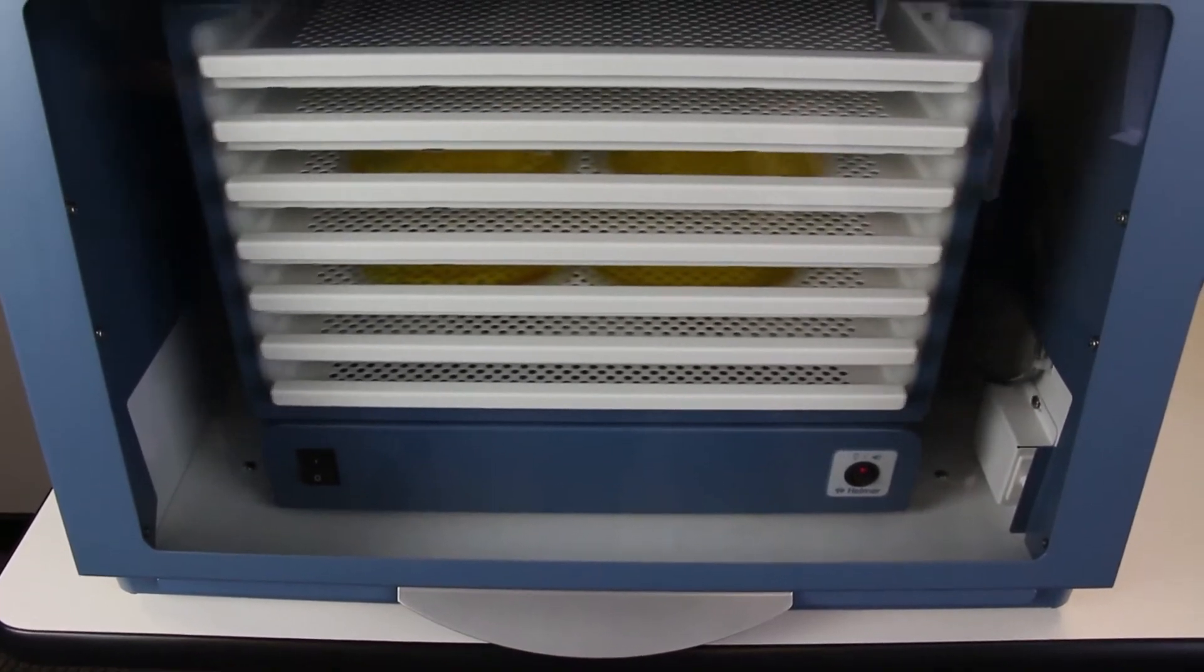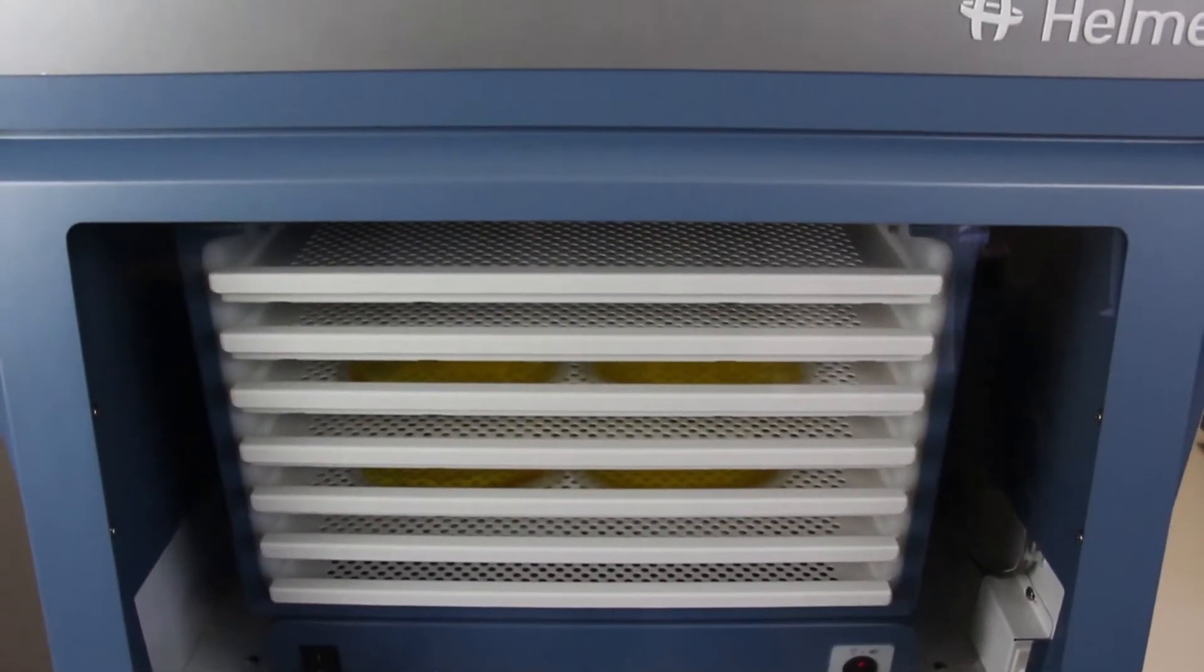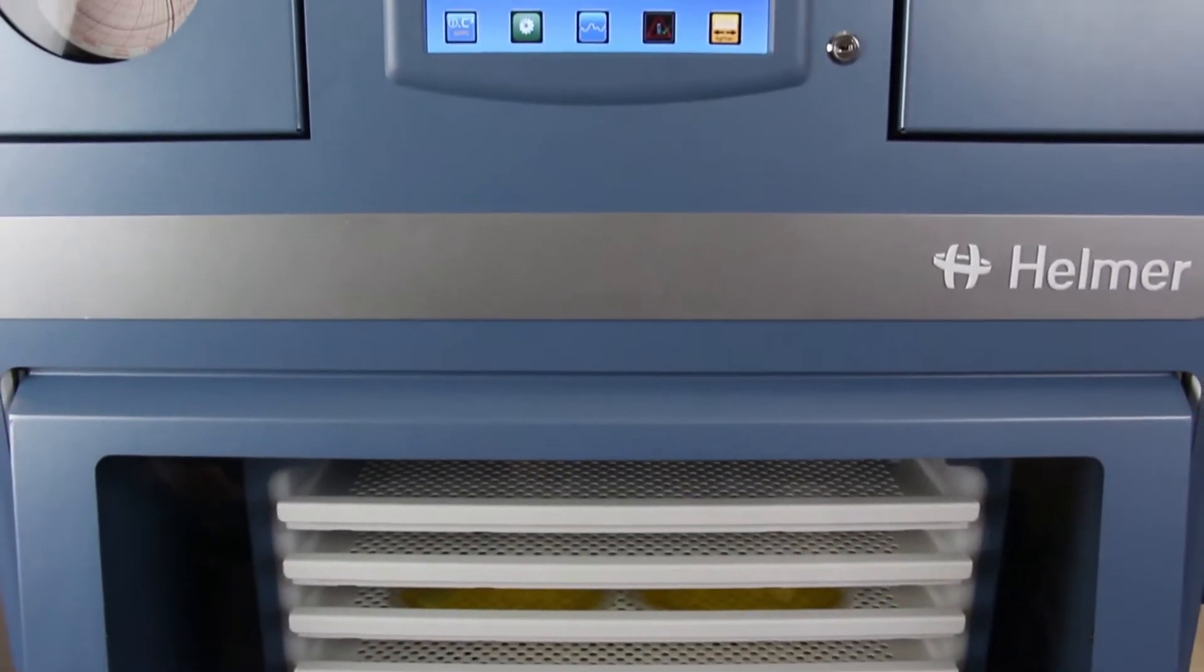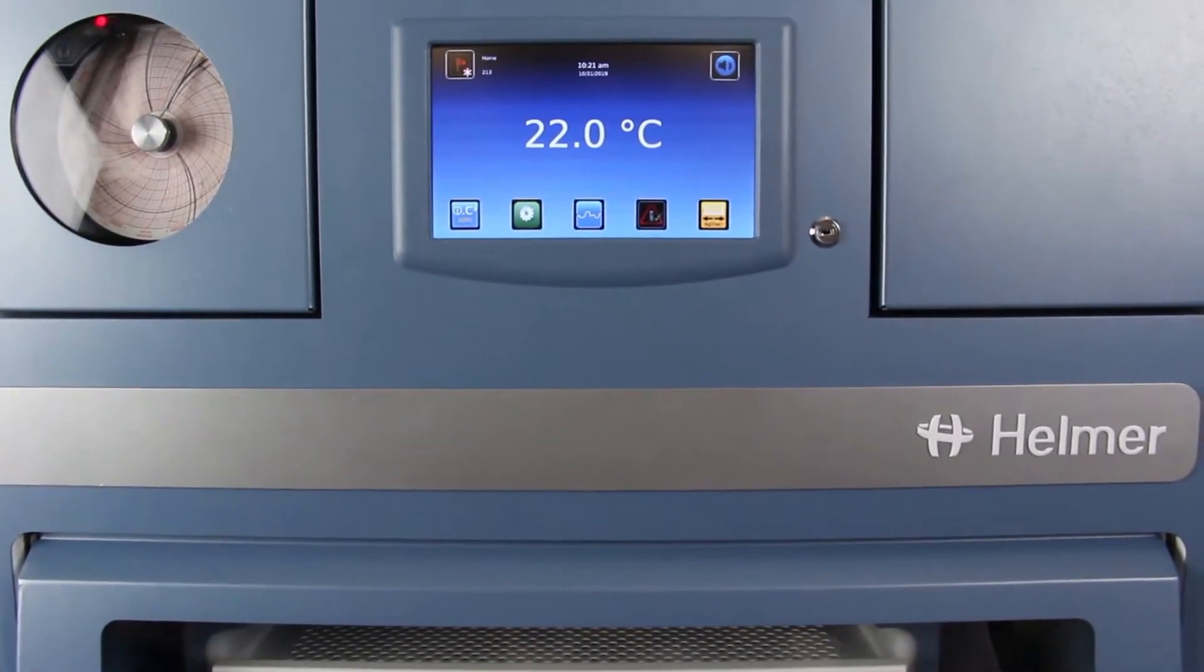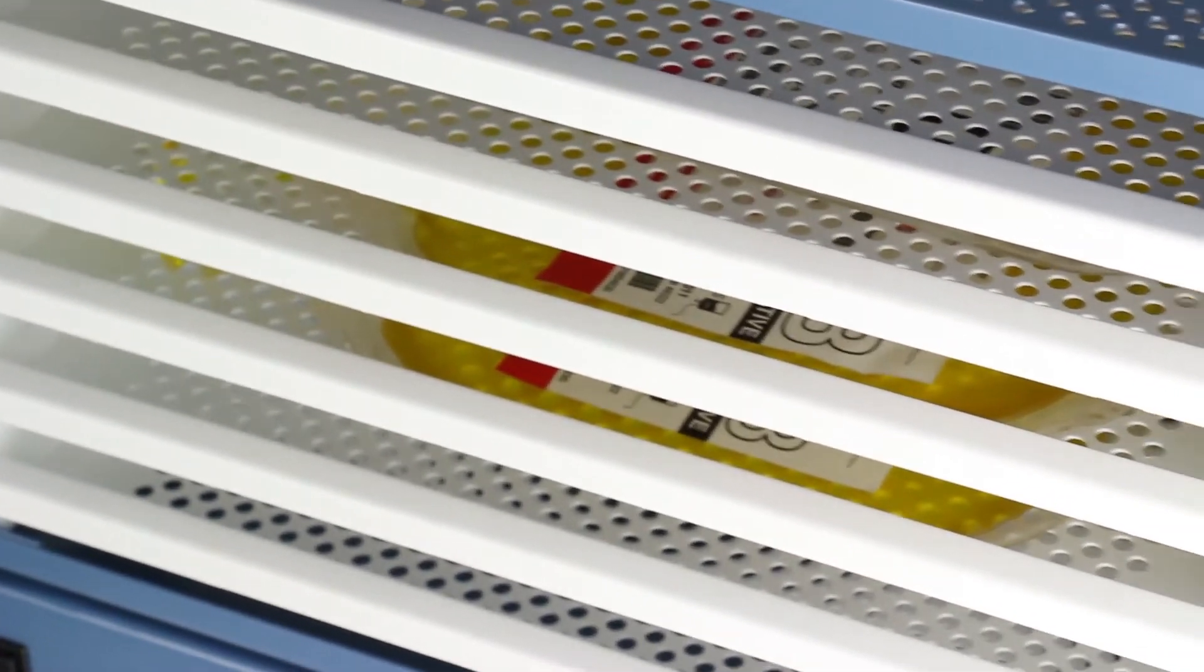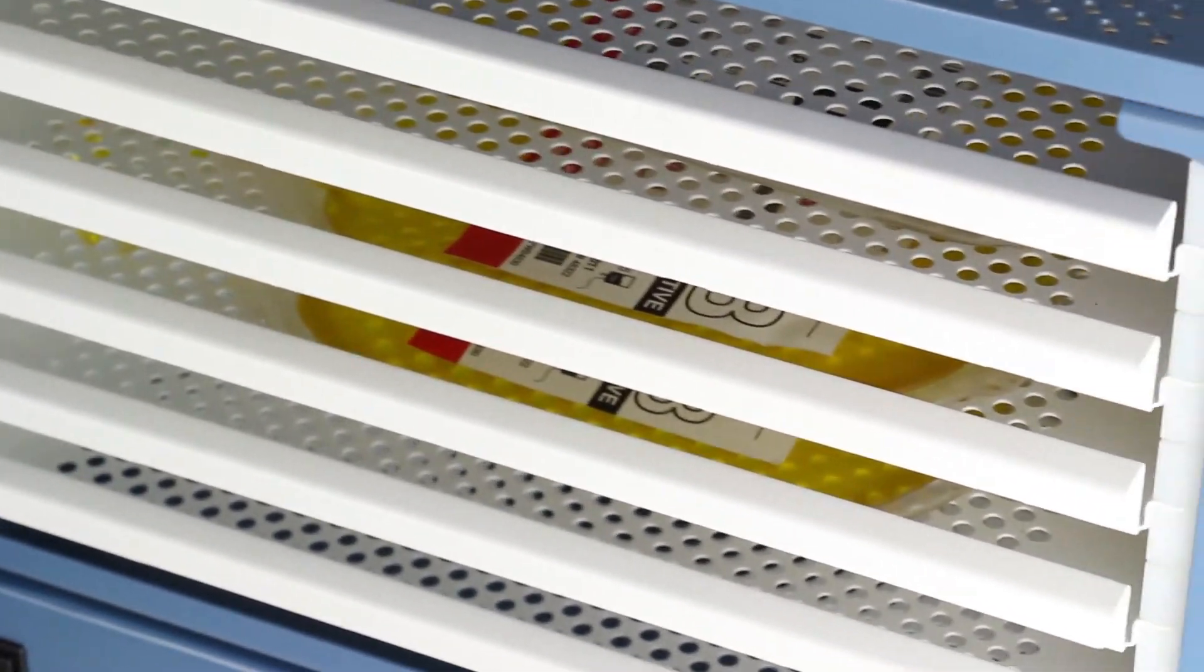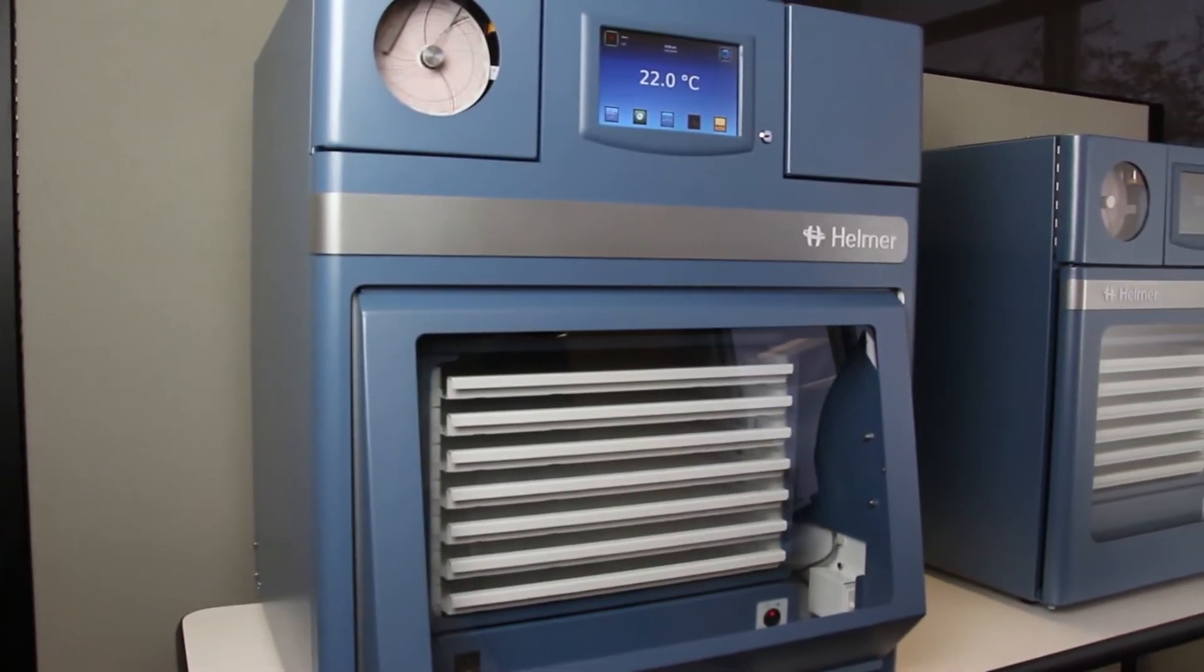Reliable platelet storage is critical to a blood bank. The constant challenge of whether enough platelets are available to meet patient needs means it's essential to have a storage system that reliably maintains agitation and the proper temperature range.